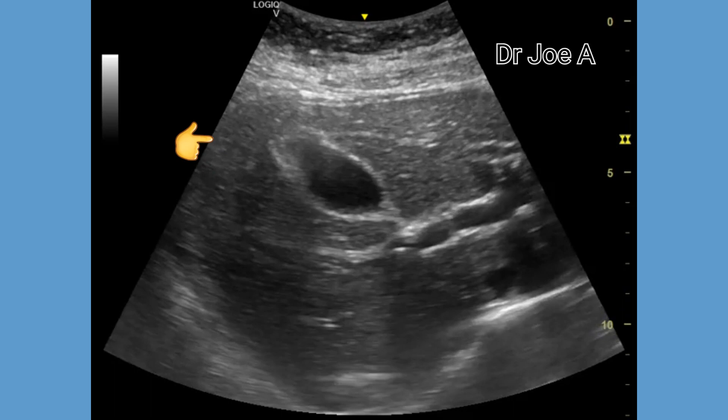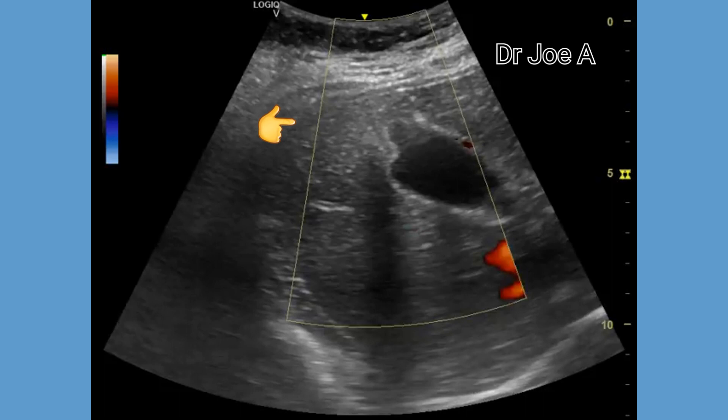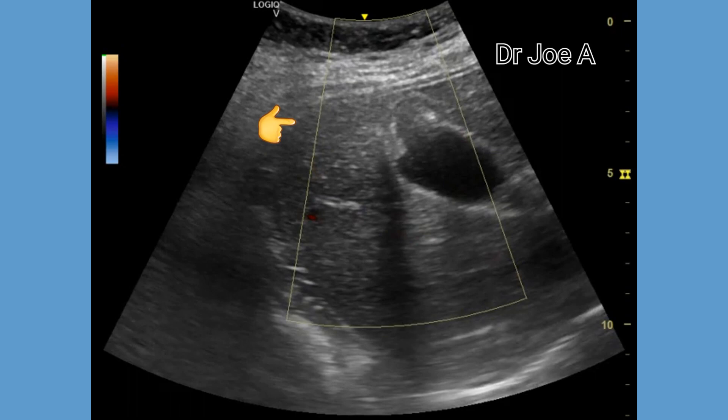Color Doppler ultrasound does not show any significant increase in vascularity in this region. This condition can mimic gallbladder malignancy.